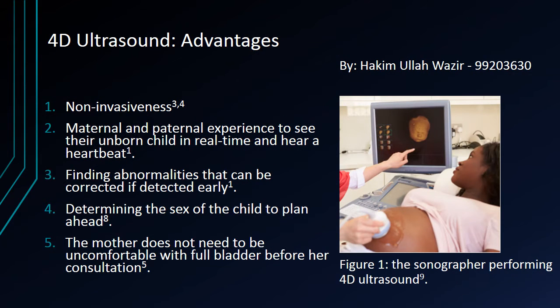The advantages of 4D ultrasound. Number 1. It's a painless, non-invasive technique. All types of ultrasound involve a smooth, handheld device that transmits high-frequency sound waves through the body and gets picked up on the screen. The sound waves are high in pitch and intensity and cannot be heard by the human ear.